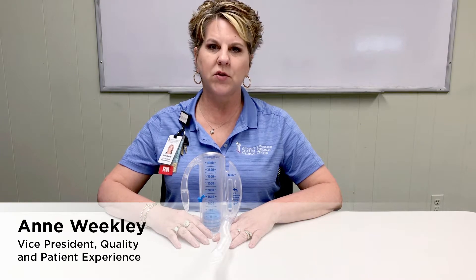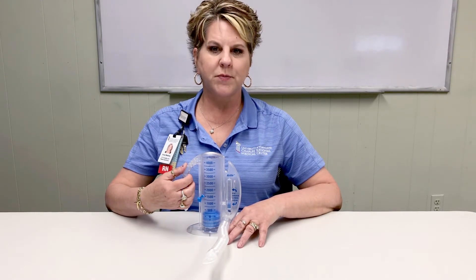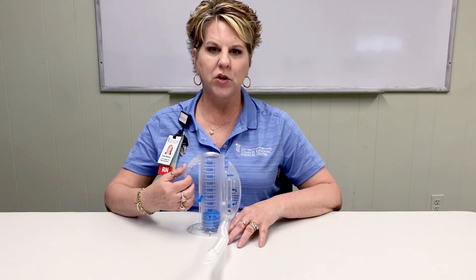Hi, my name is Ann Weakley and I am the Vice President of Quality and Patient Experience here at the University of Maryland Charles Regional Medical Center. Today I will be talking with you about the incentive spirometer and how to properly use it.